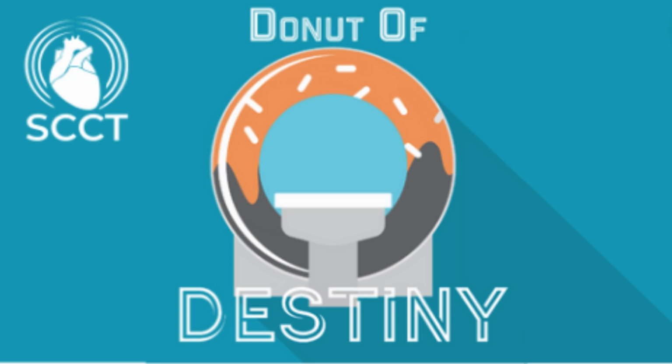Yeah, I mean, it technically doesn't make much sense, but there could be a rationale. Even if you're using systolic, you are slowing things down, and maybe you are maximizing your systolic quiet period, and your acquisition window can be shifted to a much later time than the typical one that we use. But our temporal resolution with the scanner now is 65 milliseconds, and even the systolic quiet period is of a reasonable length. So there is no real incentive to use that, but some people might be using it.